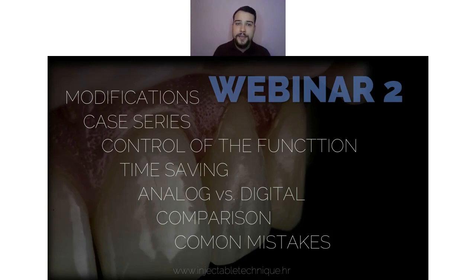We also speak about saving time, how you can make your work more predictable, easier and simpler, following the single veneering concept to save time in the finishing phase. Comparing analog and digital, as I told you. And of course, I try to mention the most common mistakes, because in Croatia we have a saying: in English, people learn from Oxford, in Croatia they learn from their own mistakes. I made all of those mistakes. I know them. I know how to avoid them, or if they happen, how to fix them. And I try to share those mistakes with you.